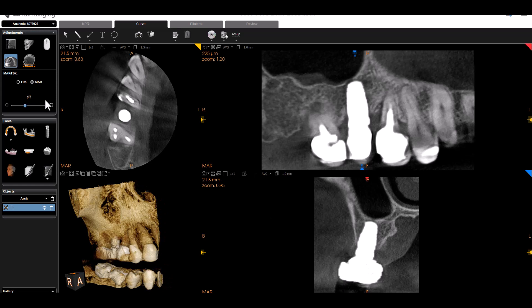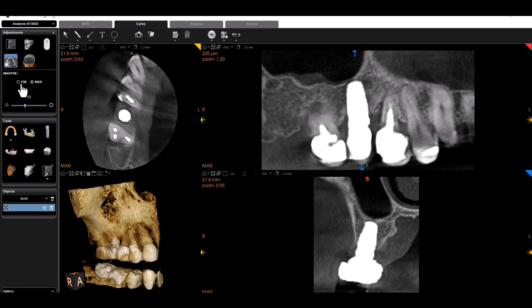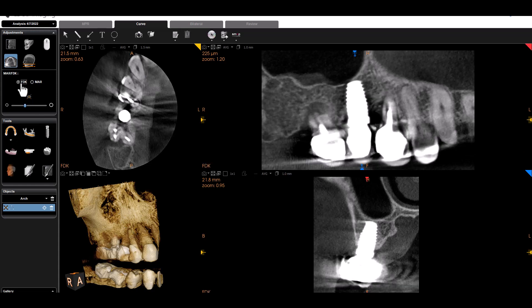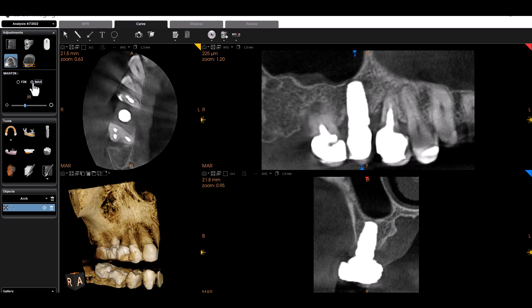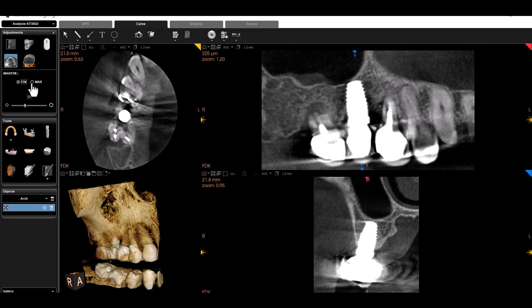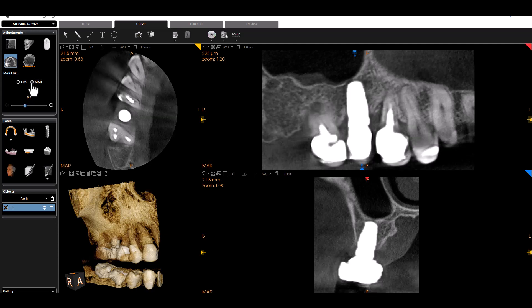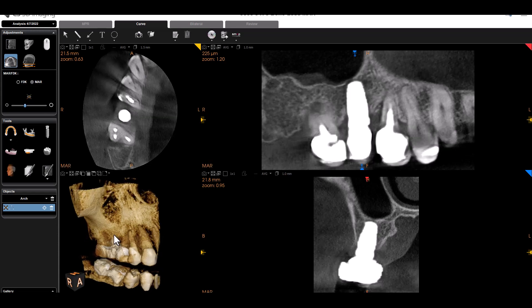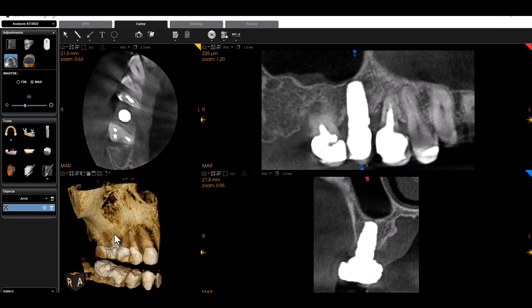It's important to note: when I toggle back and forth, it's only your MPR views — your slice views — that toggle back and forth. You'll notice the 3D rendering does not, and that's by design. The 3D rendering is not supposed to be diagnostic, so the choice was to keep it only presenting as MAR. Once it gets converted to MAR, it is only presented as MAR. The MPR views are the ones that toggle back and forth.